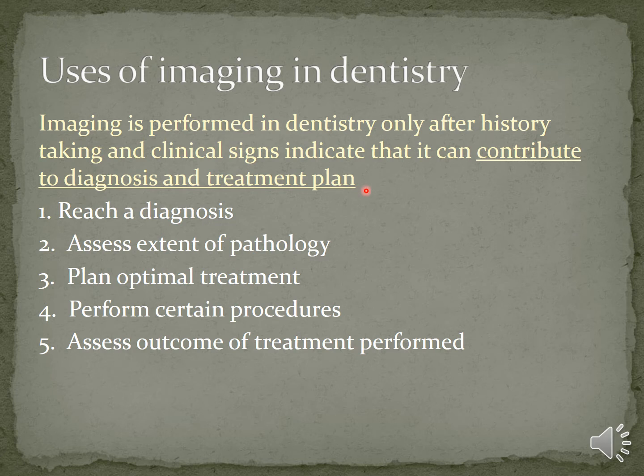So the uses of imaging in dentistry would be to primarily reach a diagnosis, to assess the extent of a pathology, that means how big is the disease that is there in the patient. In order to analyze it, you use imaging. Also to plan treatment, how to optimally plan it. I mean, on the X-ray, if you discover that there are other areas to be treated, then it probably changes the plan of the treatment.